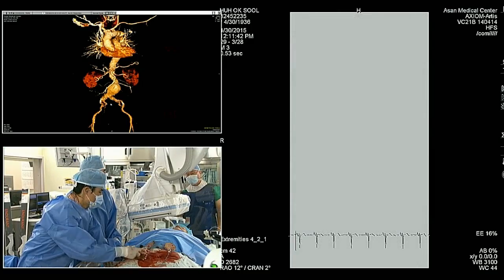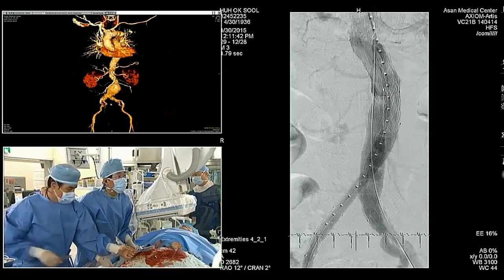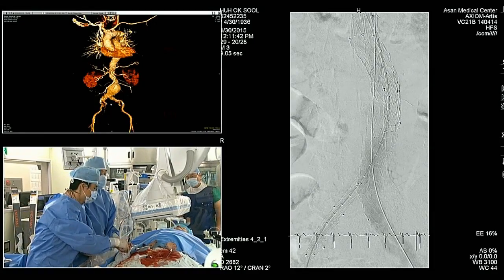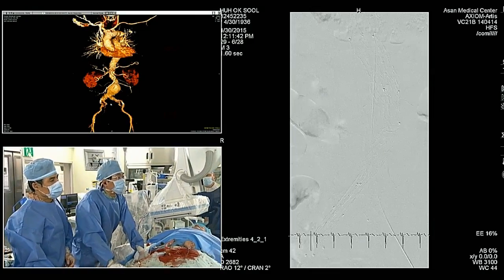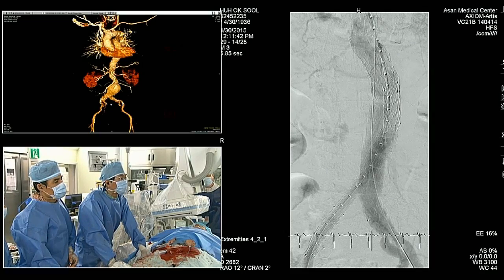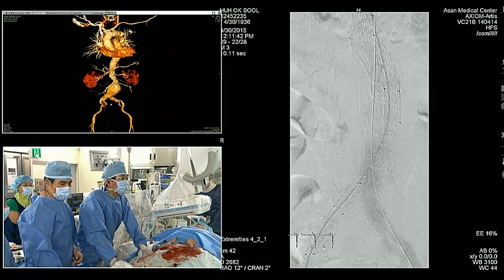Yeah, I mean, that's an operator discussion item here. I think you have a good seal. It is relatively short as far as the length of the landing zone and your coverage. You could extend it. It looks like the extension would only go about another centimeter. So I think it's operator discretion whether to extend that or not. What does the panel think? Leave it or extend it?